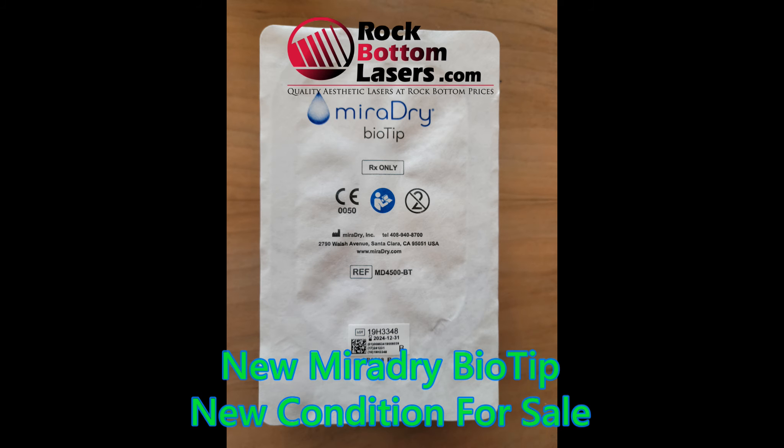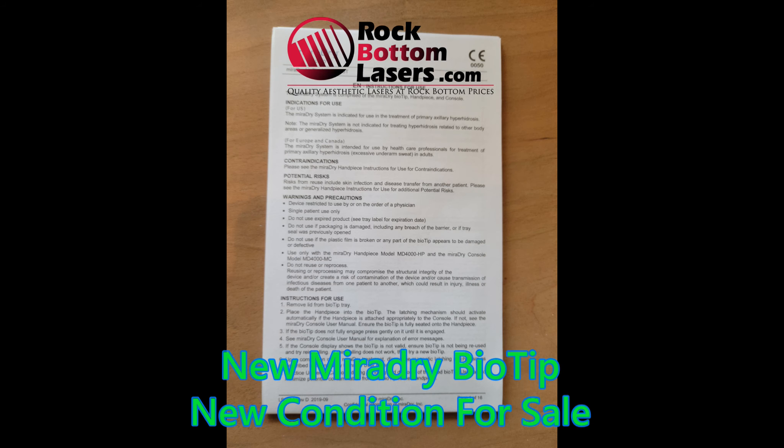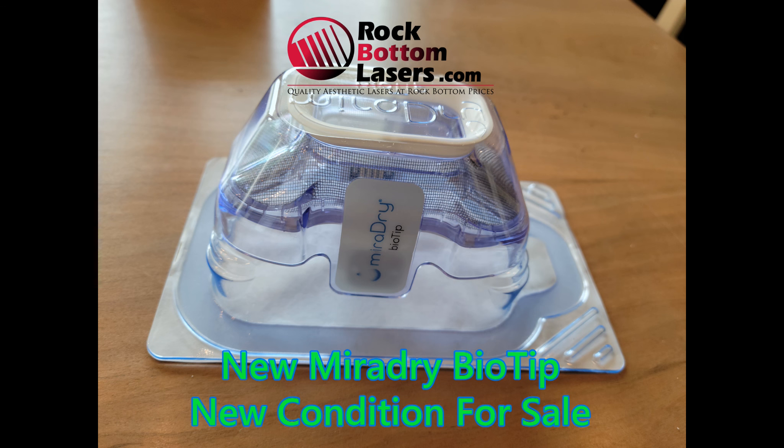These are the MD4500 tips and they are new, never used, still in the original packaging. They do include the BioTip, the marking paper, the skin width transfer, and the gel pack, and free shipping. Thank you so much.